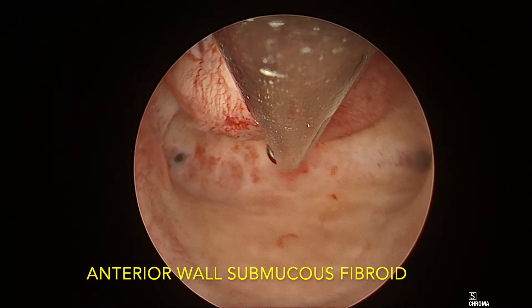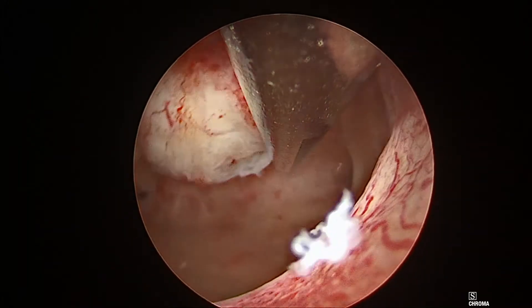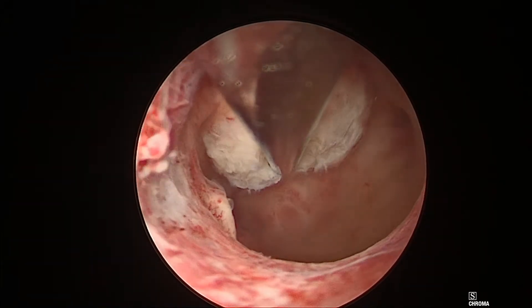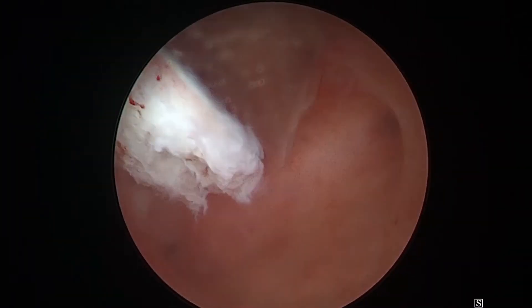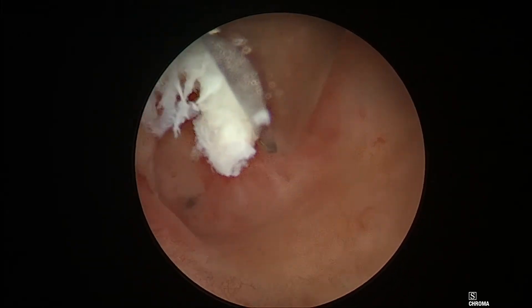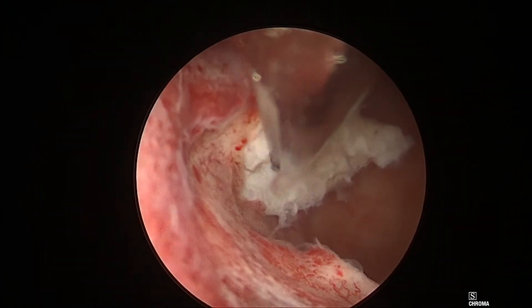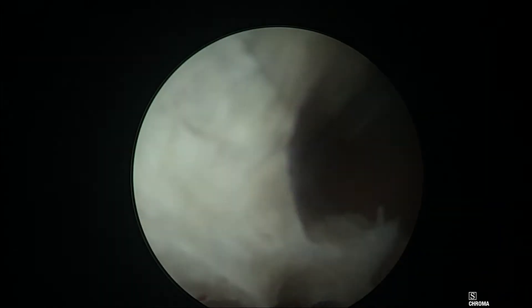I'm presenting a case of a Myosure resection of a submucosal fibroid for a patient who was suffering from excessive irregular menstruation. An ultrasound scan was performed first, which diagnosed the submucosal fibroid, following which an outpatient hysteroscopy was performed to confirm the location and the exact size of the fibroid. This procedure was performed as an office procedure.